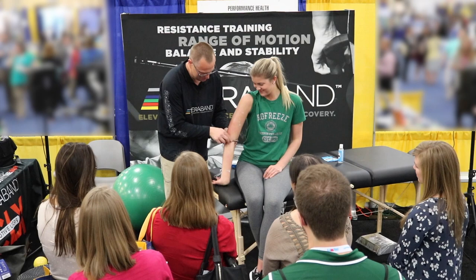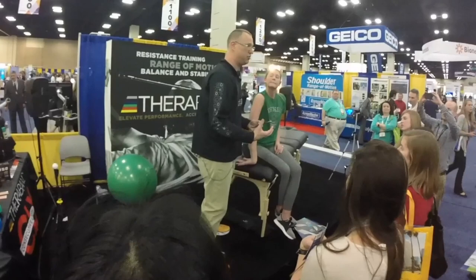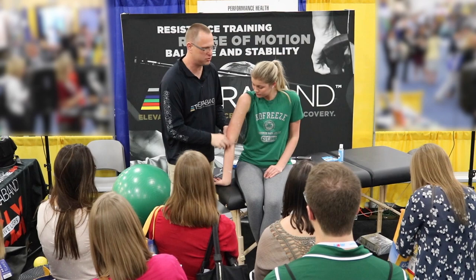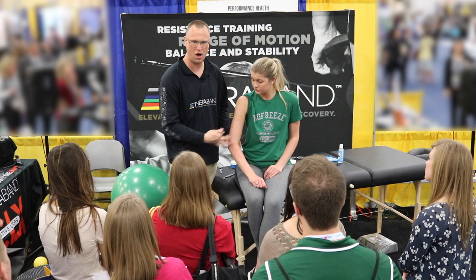She has used this arm with overhead activities — some volleyball — and I just want to spend some time there. As a clinician, this is so easy on me. I do manual therapy with about 90% of my patients, and after a few patients of digging in with your thumbs you're shaking out your hand. With the instrument, it's so light in my fingers and I'm able to aggressively work those common extensors.